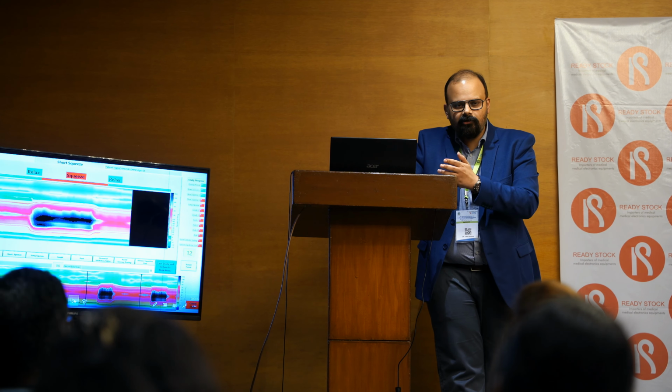Cough. So cough is very important, particularly the first part of the London protocol, the squeeze and the cough, for patients who have come to you for evaluation of incontinence. Let me go back to the cough. How I normally say it is that you should have a good cough reflex if your sacral spinal reflexes are normal. If they are abnormal, you have a spinal problem, you have a cauda equina, these cough reflexes will be poor. If you have a normal cough but the anal canal reflex is not coming, it may be a higher up spinal injury possible in the same patient.